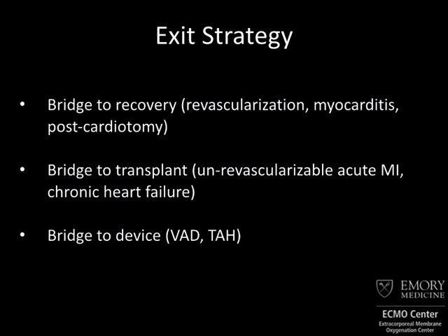The most important thing when you're considering cannulating someone for VA ECMO, however, is the exit strategy. And I think this is the most important thing that everyone thinks about: what is your exit strategy? And there's this idea of bridge to recovery, which essentially says that somehow that native heart is going to get better. We're going to revascularize it somehow, or the patient has myocarditis and we think they're going to recover, or maybe it's post-cardiotomy and they had bad cardioplegia and we're going to hope that goes away and their heart gets better.